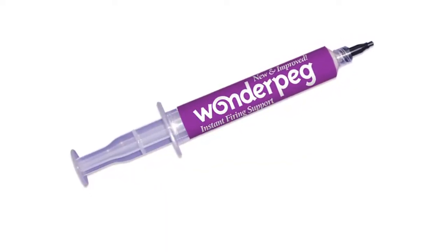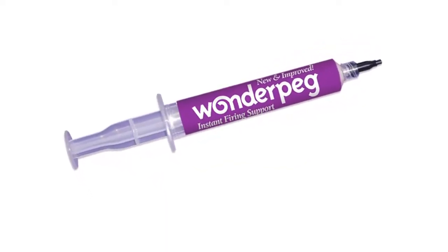Hello, I'm Gina Parker and I'm one of the partners in Dental Creations Limited and I'd like to talk to you today about Wonder Peg. Wonder Peg is an instant firing support. There are a number of me-too products like Wonder Peg, but based on my knowledge of the industry we have the only instant firing support that is specially formulated for the dental industry.